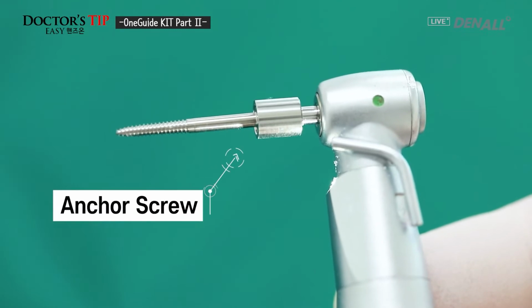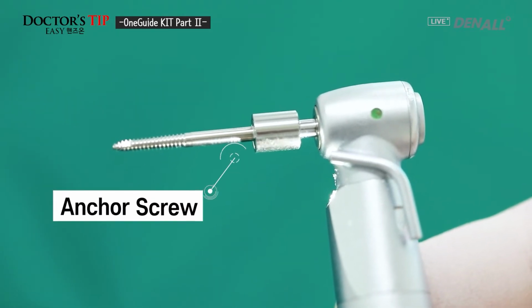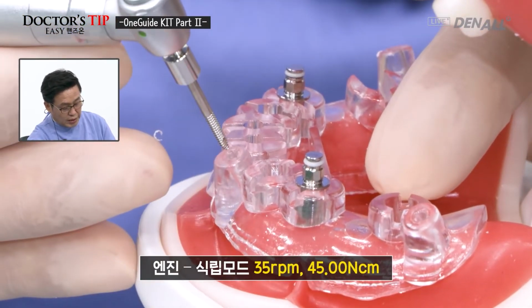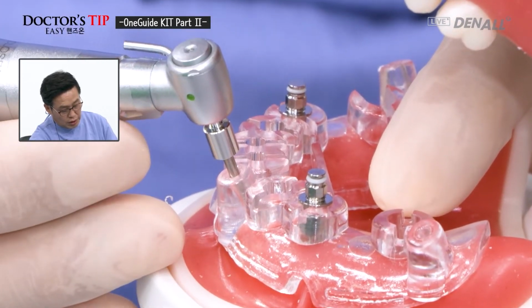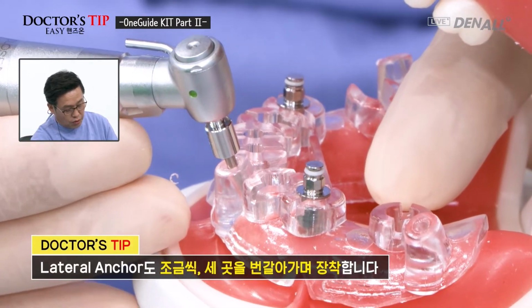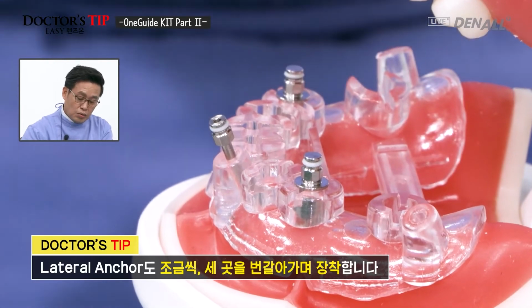Go to placement mode. Use anchor screw. Same with vertical anchor, the lateral anchor. Apply them. As you can see, it's not fully tightened. It's about 80%. And then remove the anchor screw.